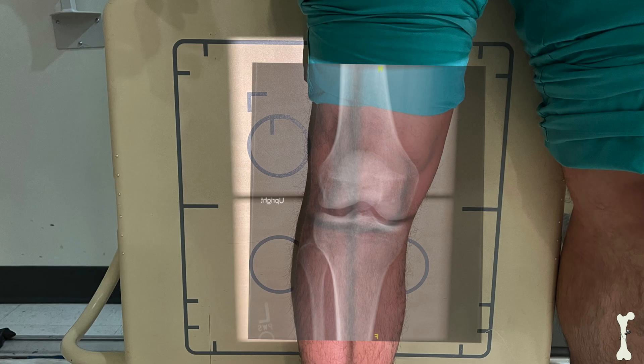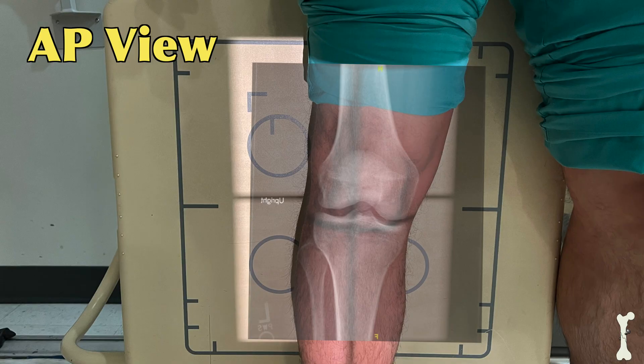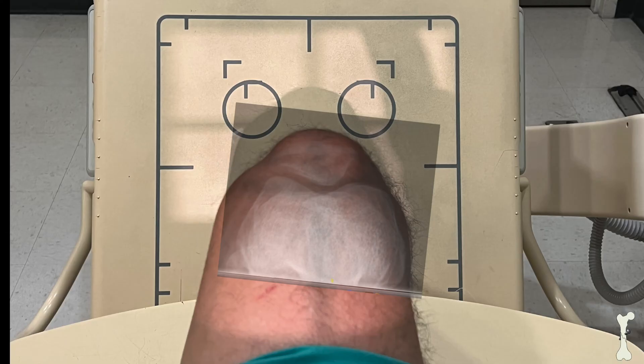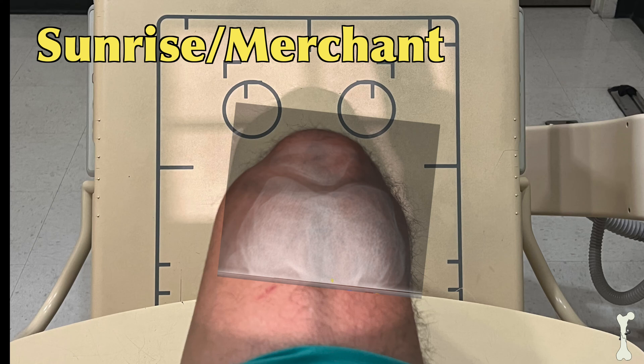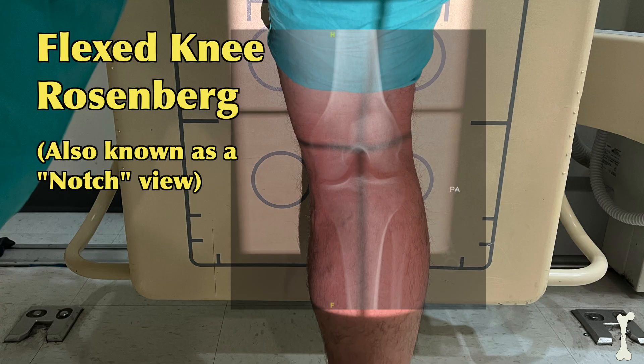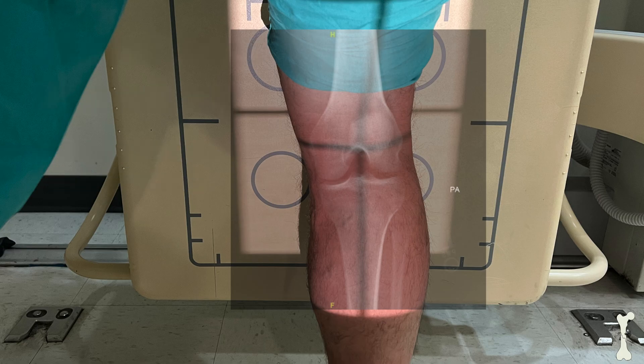There are four main x-rays that we obtain when initially evaluating knee pain. The first x-ray is called the AP view, and it's looking straight at the knee. The second x-ray is called the lateral view, and it looks in from the side. The third x-ray is called a sunrise view, or also called a merchant view, and this looks straight down the patella femoral joint, also called the kneecap joint. And finally, this x-ray is called a flexed knee view, or often called a Rosenberg view, and this takes a look at a different area, especially of the thigh bone and what we call the femoral condyles.